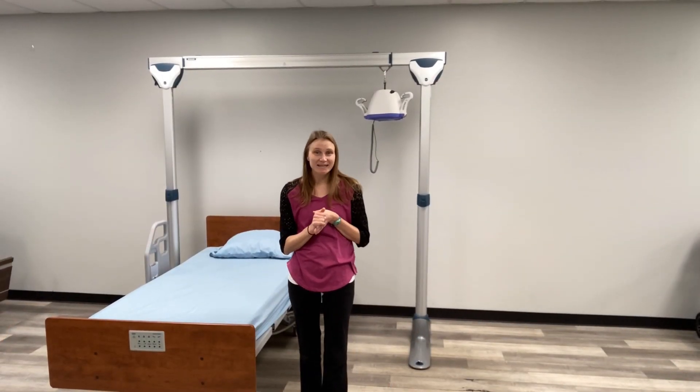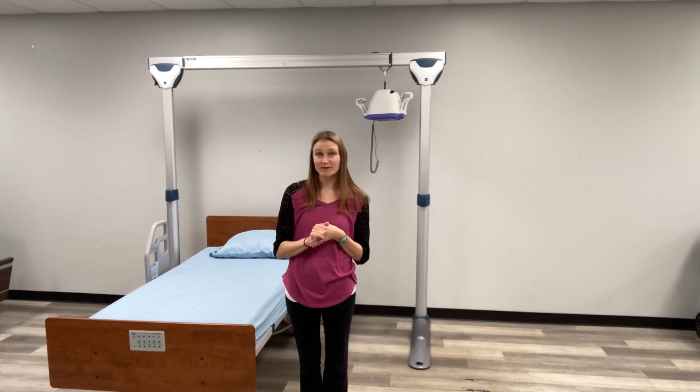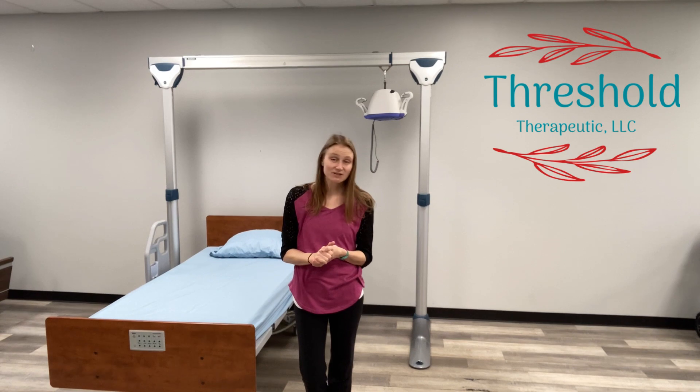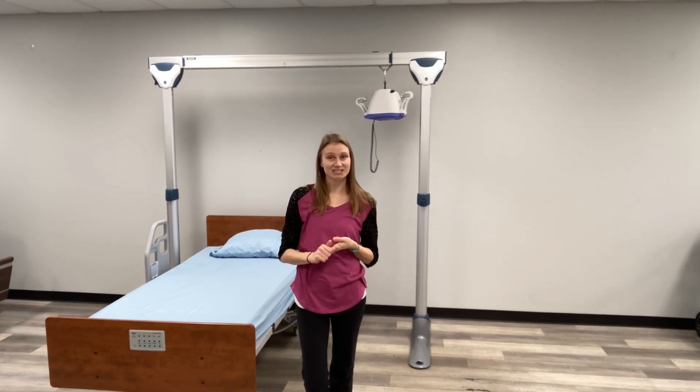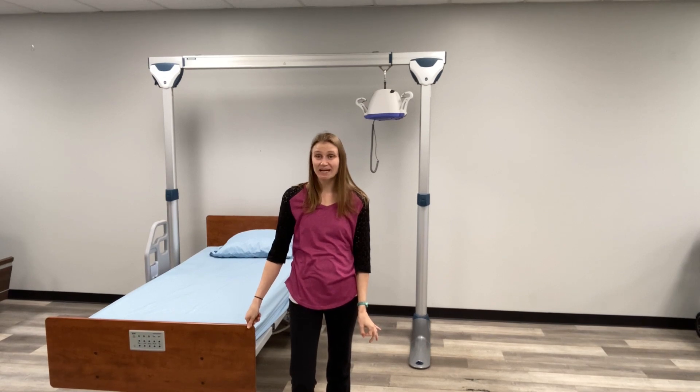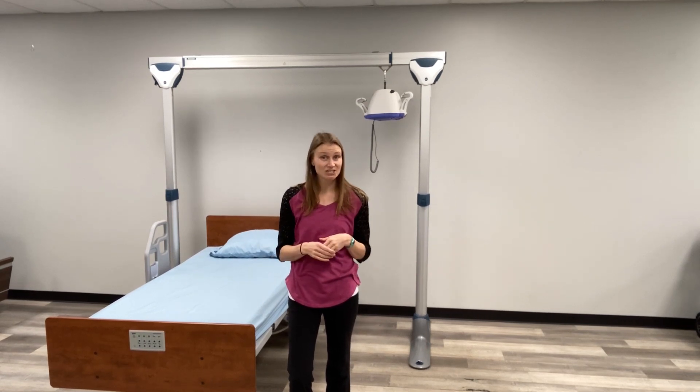Hello everyone, my name is Maddie Applitz. I am an occupational therapist and owner of Threshold Therapeutic. Welcome to the continued series with the Home Care OT on patient lifts. I am back with my friends at CareWorks Mobility in Charlotte, North Carolina to continue our discussion on patient lifts.